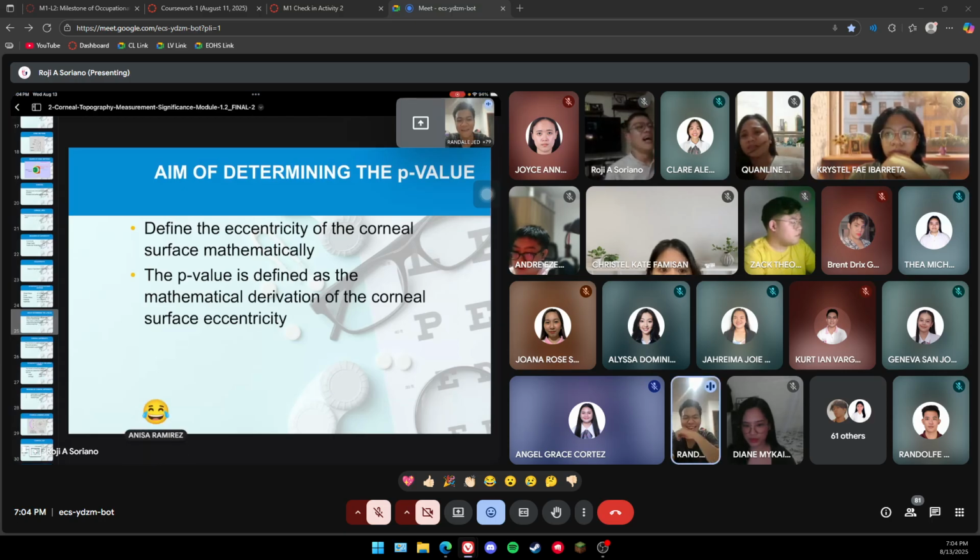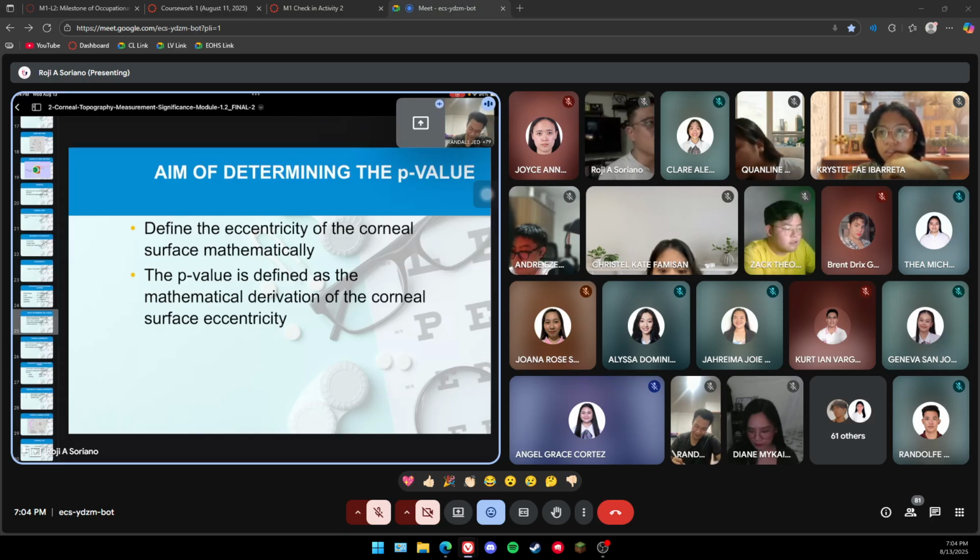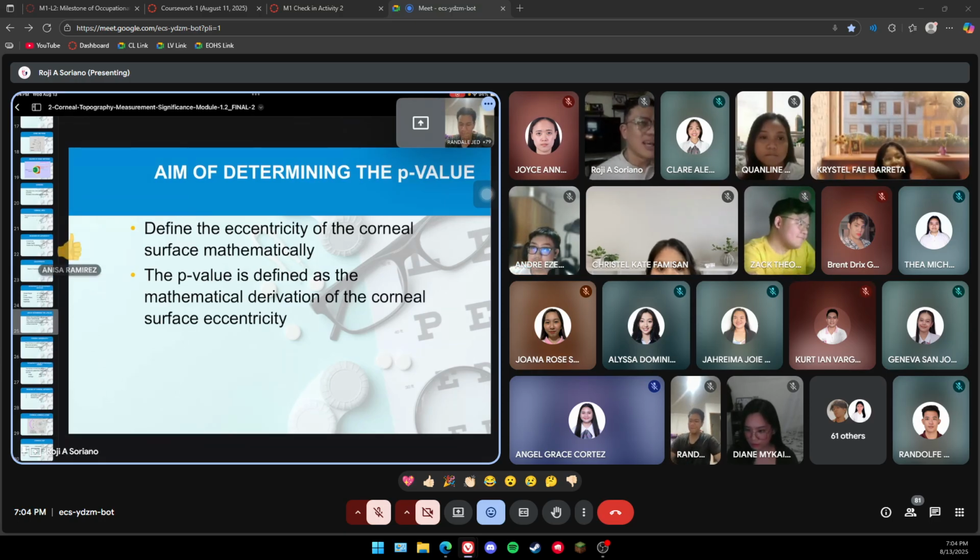Contact lens po. Okay. The subject is contact lens, right? We need to get the right measurement of the cornea so we can get the right measurement of the contact lens. Very good. Are we learning? See, the way you guys are answering is the same way I can sense how you think, right?